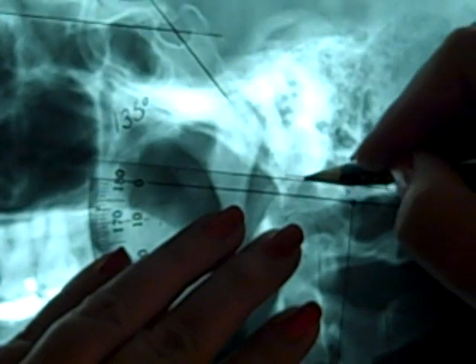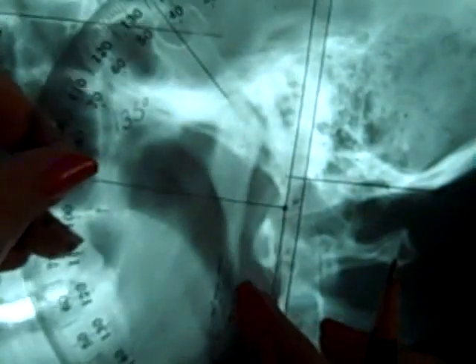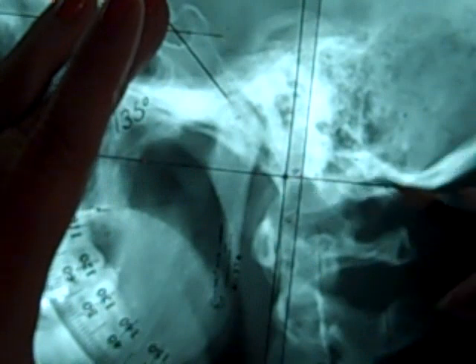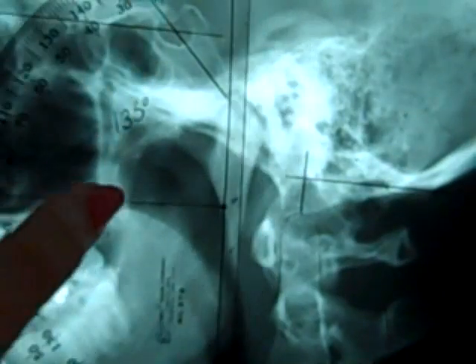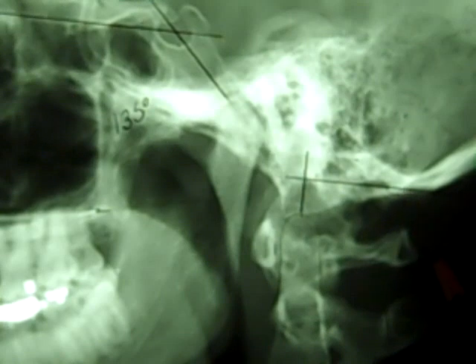Continue this line on towards the back of the film. And the second part of McRae's is that you want to draw a line that is perpendicular to that line at the apex of the odontoid process. So I'll draw this one like that. Okay, McRae's has 2 findings. The first finding is that you should see some bony tissue, and I do. You should see some bony tissue below the line. That's the first part. And we do.